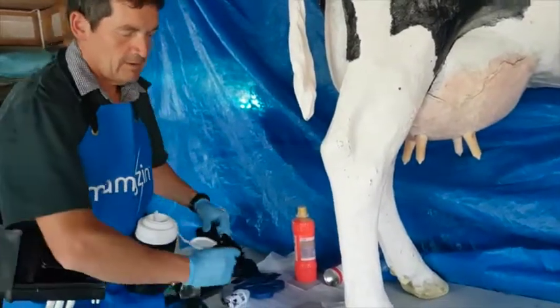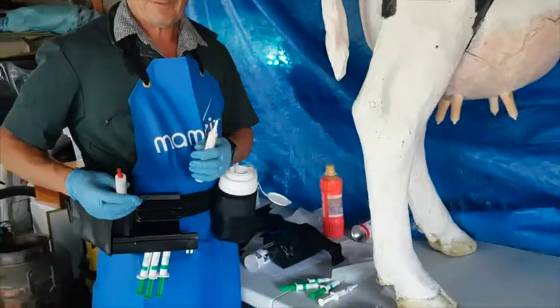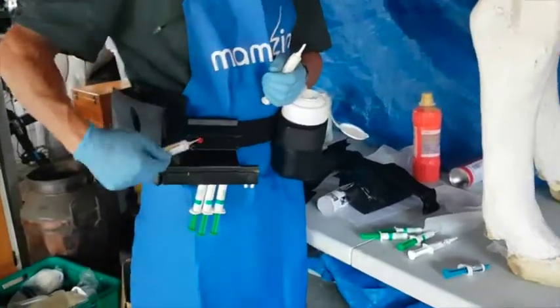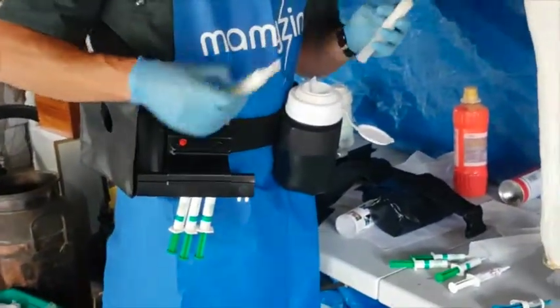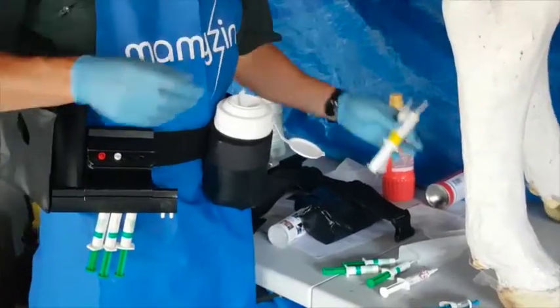In the colostrum mob I might be wanting to use a lactating intramammary, and that's where the cap remover comes in — it's a specialized insert right here. Here's Mastilone — cap off. All good.